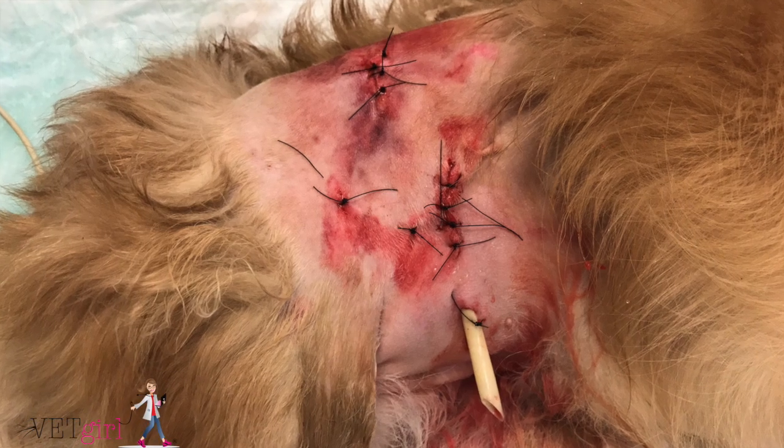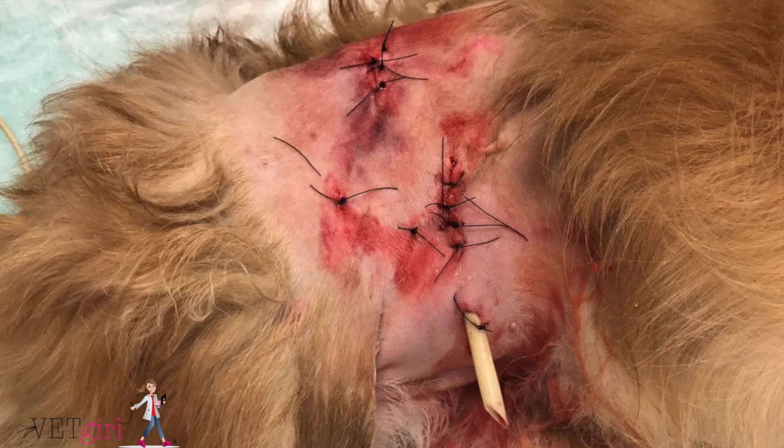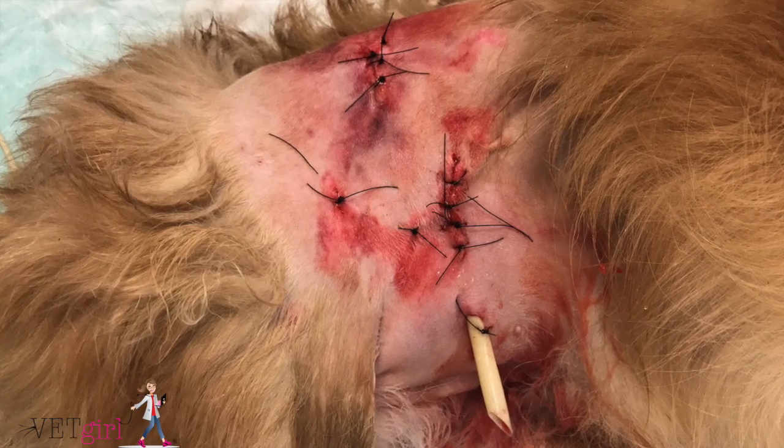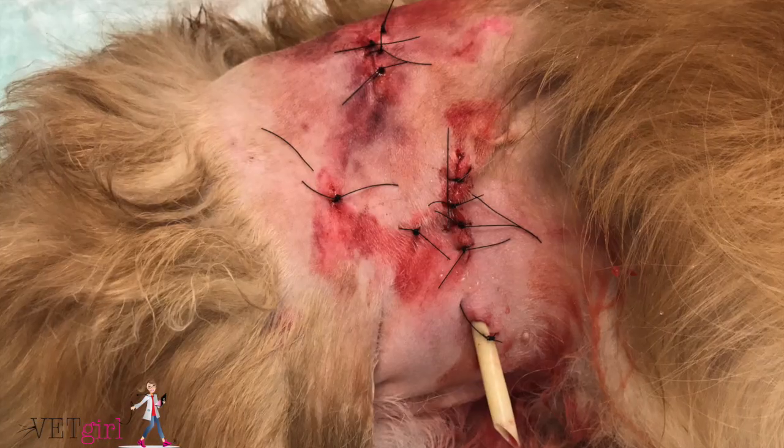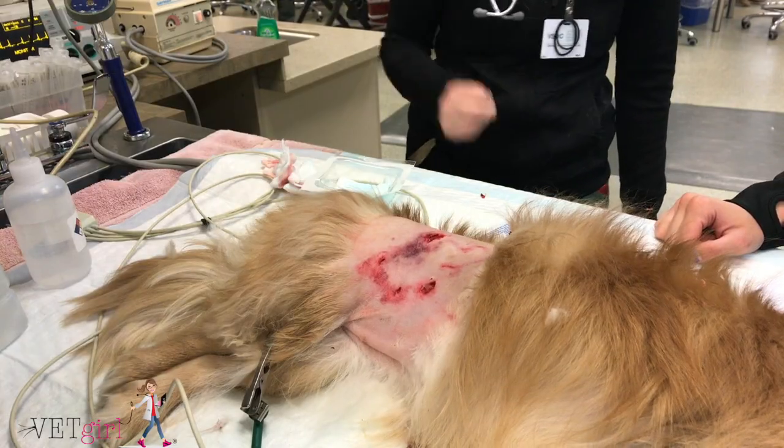In this VetGirl video, we demonstrate how to place a drain in a patient following a bite wound trauma.